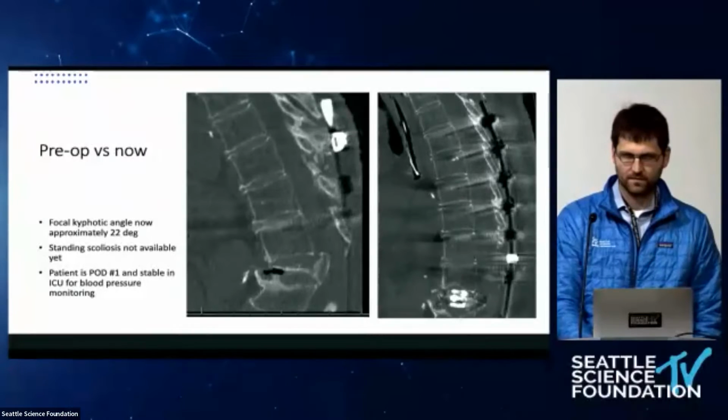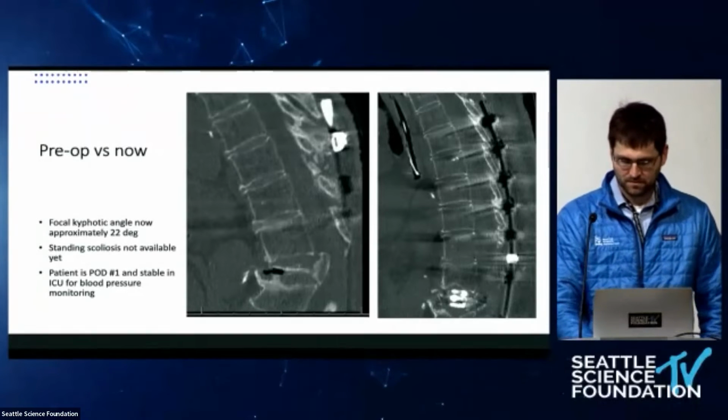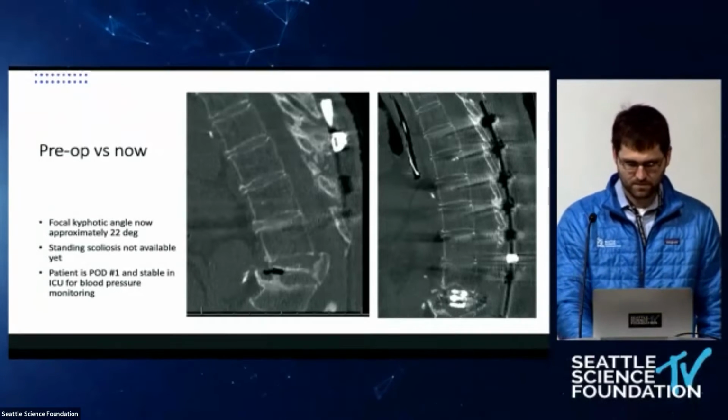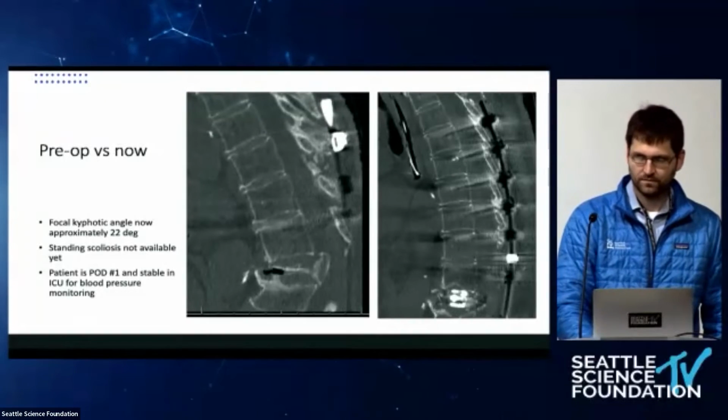You can kind of see what we did. We call it an intradiscal osteotomy, when we just go in and basically stay within the disc space. This one was kind of like a vertebra plana. Yeah, so we just had the back wall was really stuck to the dura. I bet that was a challenge. Yeah, so we had to kind of shell it out.